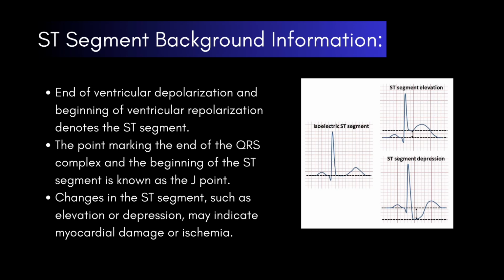I have a nice picture to the right to depict a normal isoelectric ST segment and what ST segment elevation is and what ST segment depression is. We'll be going through this in more detail in the upcoming slides. Moving on.